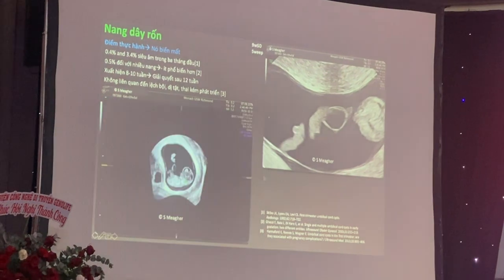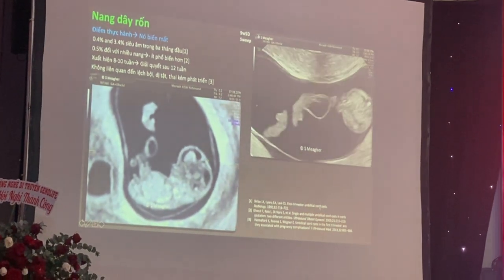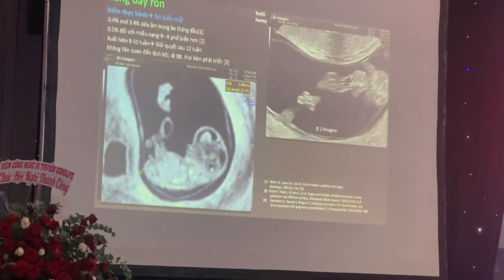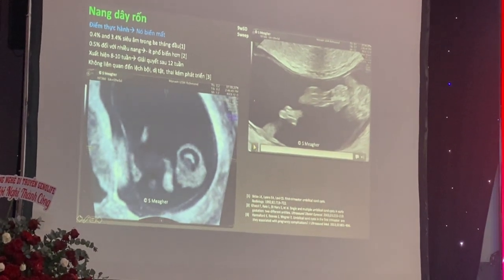Lastly, the umbilical cord. You see cysts on the umbilical cord, and you ask the question, Simon, do you worry about cysts in the umbilical cord? I'll say to you, well, it depends when you do the scan. You do the scan at 10 weeks and see umbilical cord cysts, I don't worry at 10 weeks because they're gone by 13 weeks.